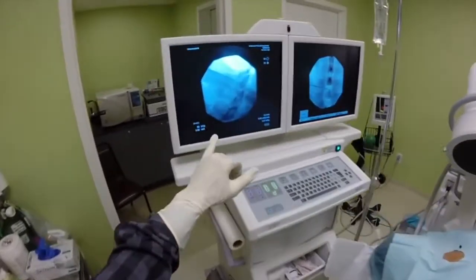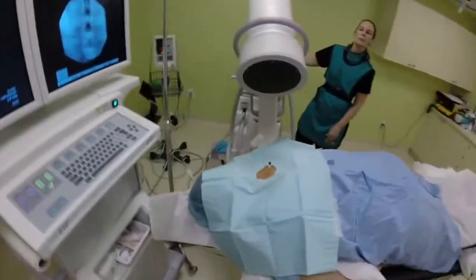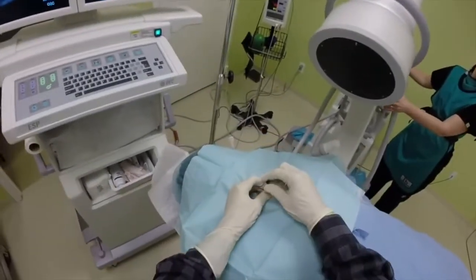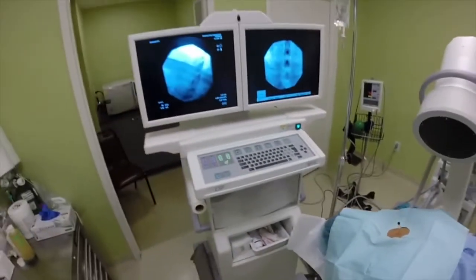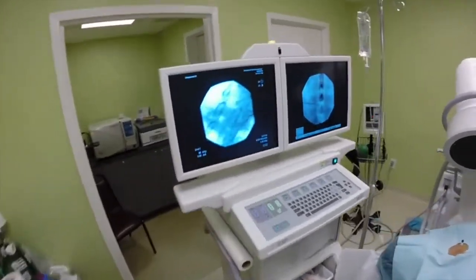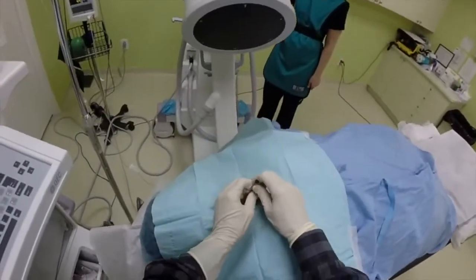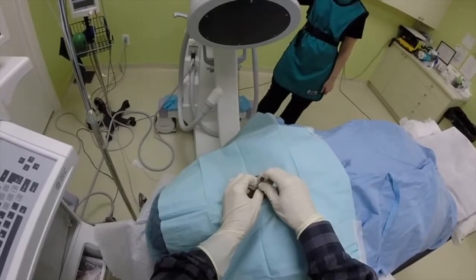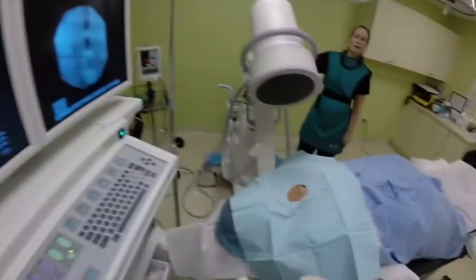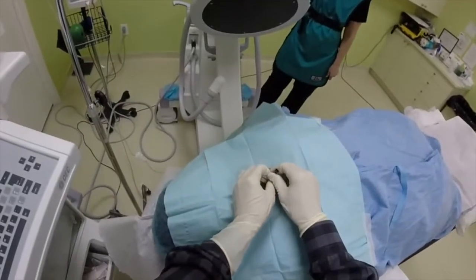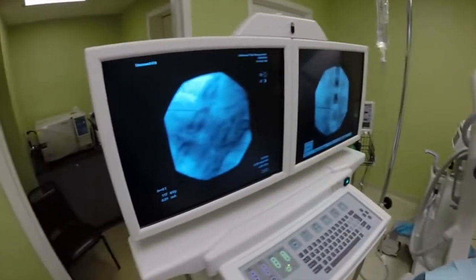My goal is the ventral interlaminal line — I'm far away, I have a long way to go. So I will advance my needle until it's close to the ventral interlaminal line. It's kind of close.